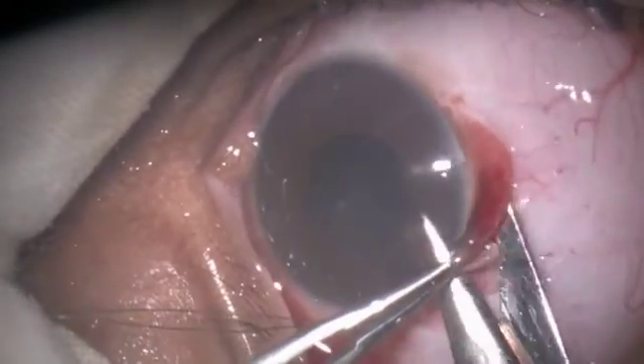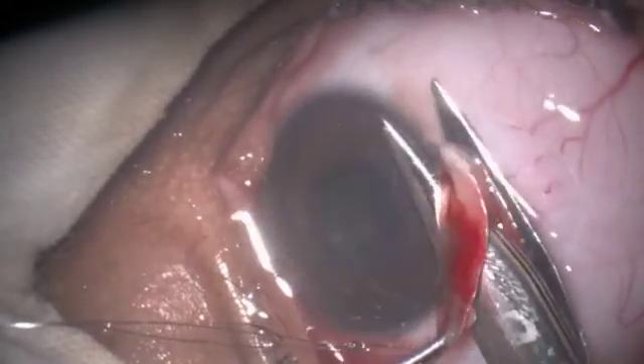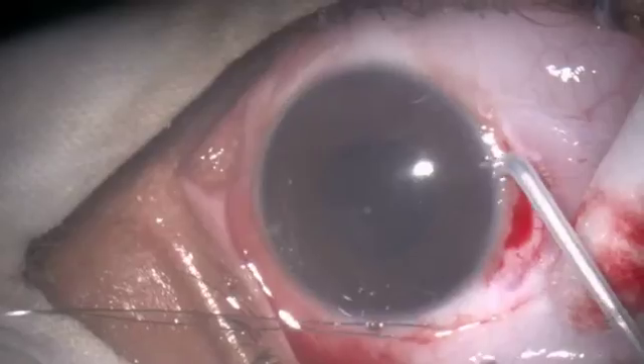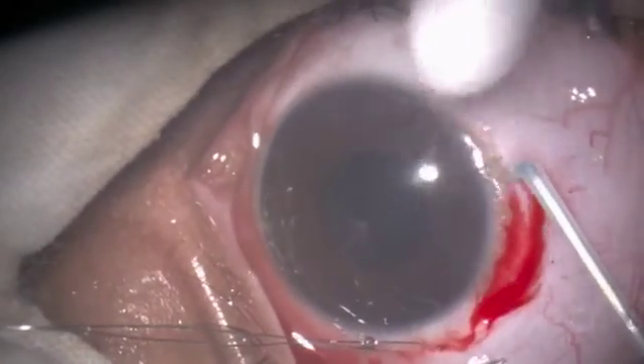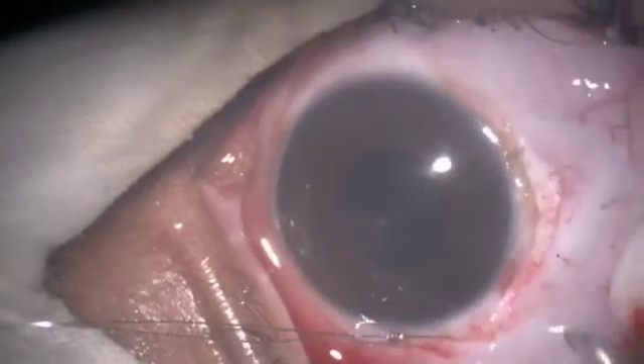Cutting the nevus close to the limbus. Some nevus is left at the limbus, which can be removed with the 500 micron tip of the Fugoblade.